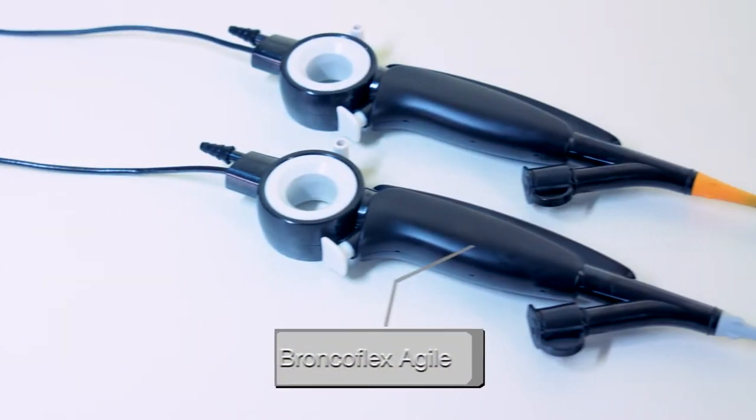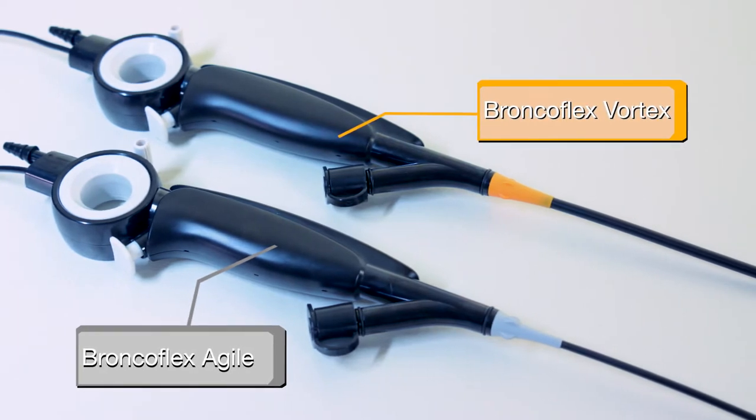The BroncoFlex is available in two sizes that are color-coded: gray for BroncoFlex Agile, and orange for BroncoFlex Vortex.